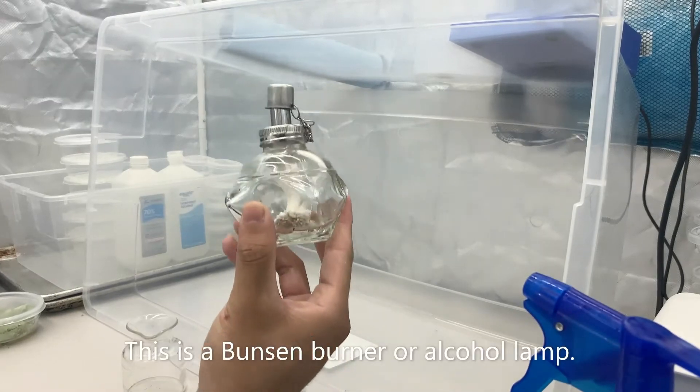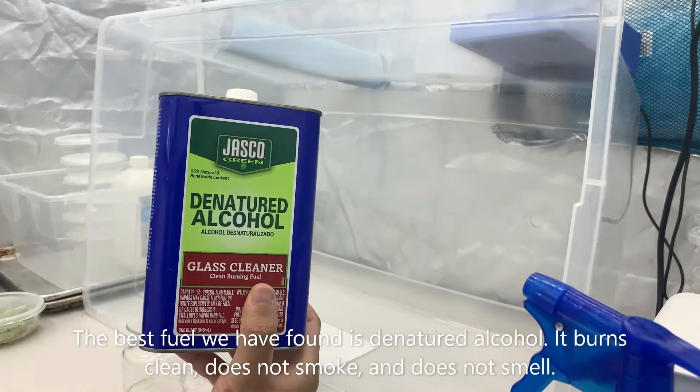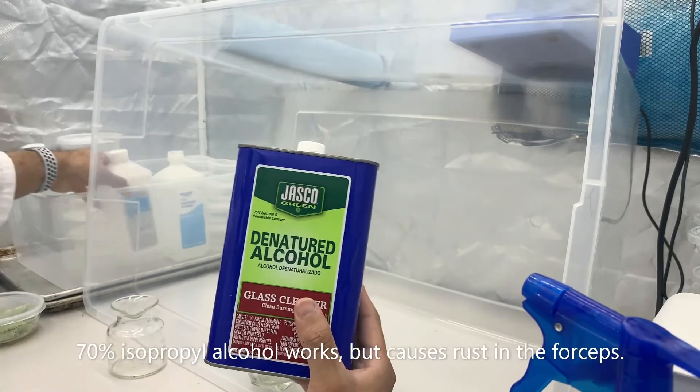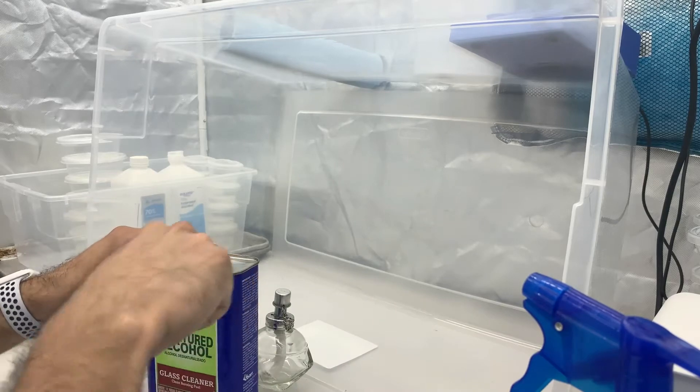This is our Bunsen burner or alcohol lamp we're going to be using today. The best fuel that we've found is denatured alcohol. It burns clean, it doesn't smoke, and it doesn't even smell. If you don't have access to that, the 70% isopropyl alcohol definitely works. It just causes a little bit of rust in the forceps.